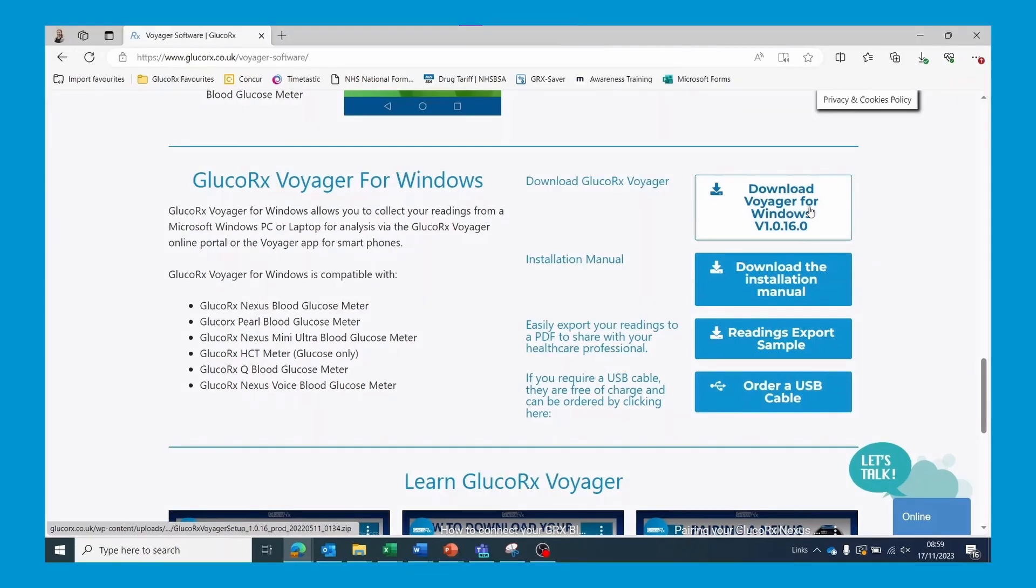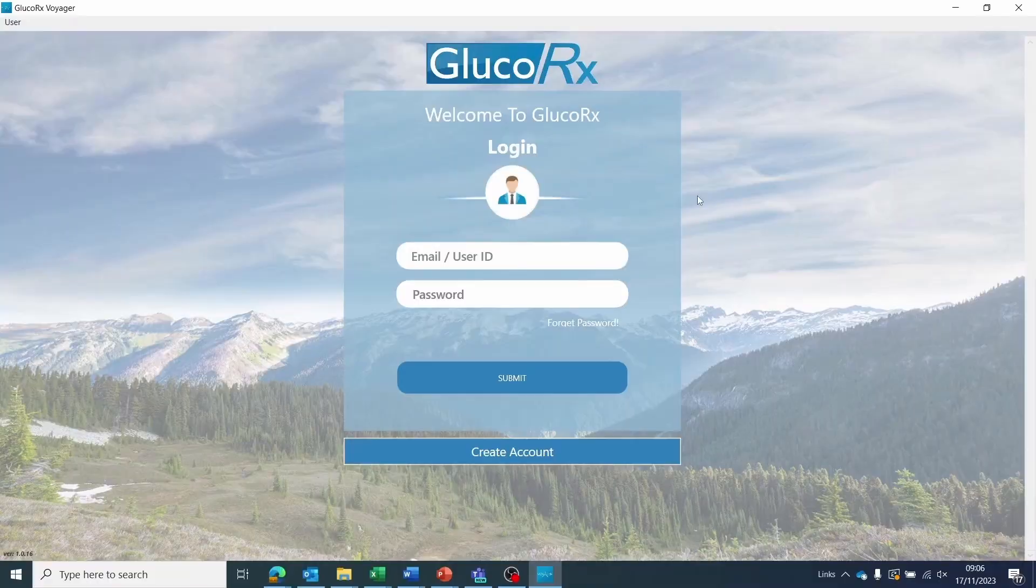Please select the download Voyager for Windows option. Once you have downloaded the GlucoRx Voyager software, open the main login page.